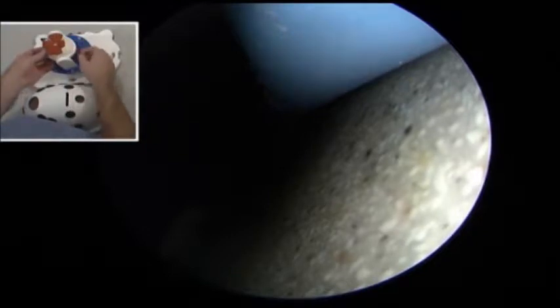The other thing that's important to note is if you're going to use any anchor that involves a punch, you want to have this little twisted knob on the side that you're going to be punching to offer additional support so that you don't knock the inner portion of the module down. For anchors that do not require a punch, this is not as important. I'm going to go ahead and put the opaque dome on.